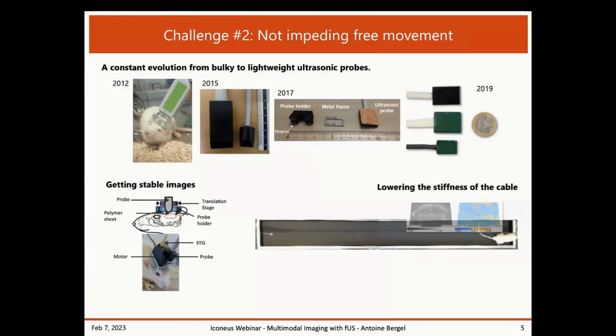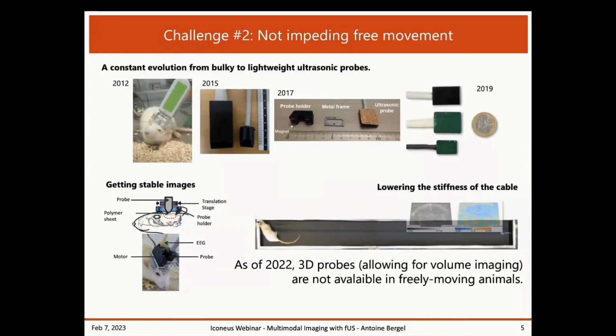And the last one, of course, is the cable. The cables can be pretty stiff, but if you manage to help and follow the animal with the hands, there are also other systems that have been developed after that, and you're able to have your animal roam around. It looks super free, can turn around easily, gets its rewards, and runs and forages normally.